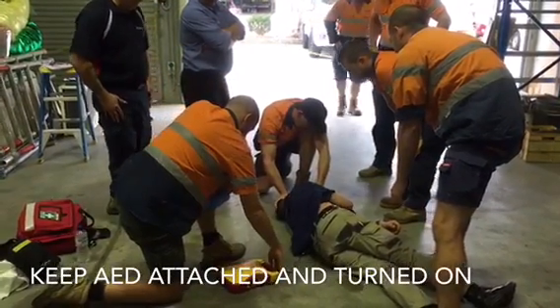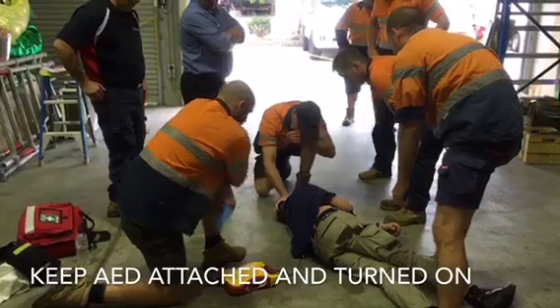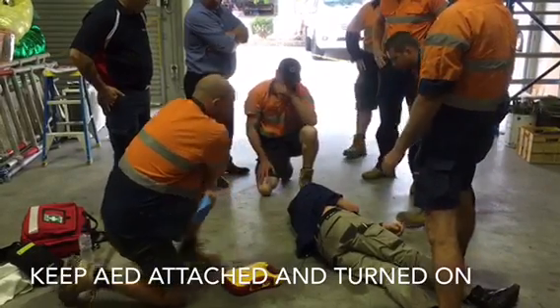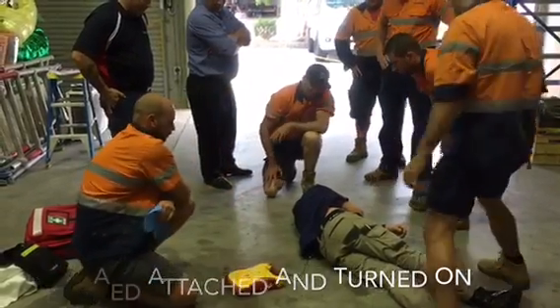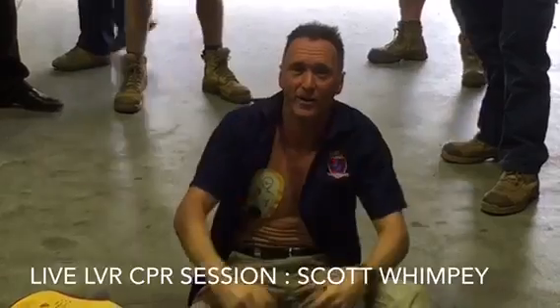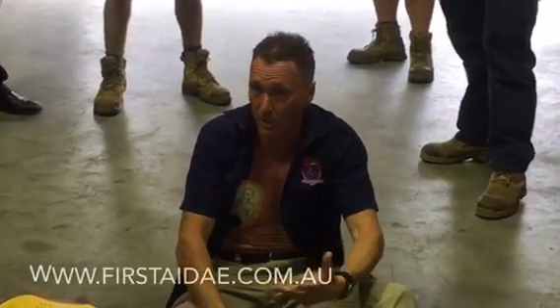Stop now. Do not touch the patient. Analyse heart rhythm. Do not touch the patient. Rescue, move to safe area. Person in arrest, start CPR.